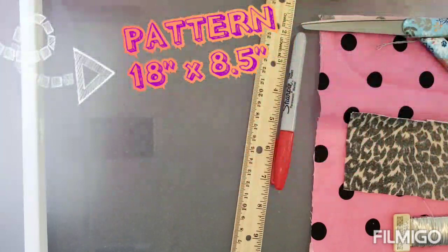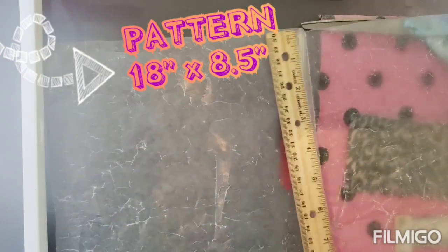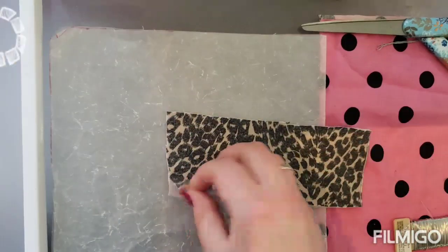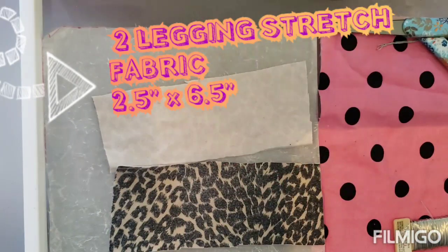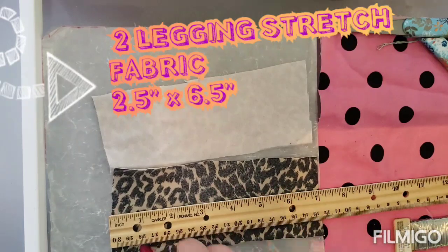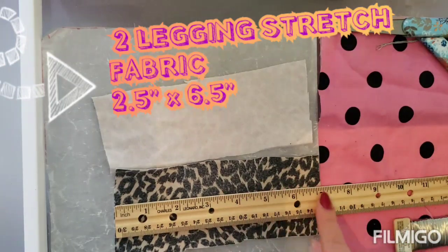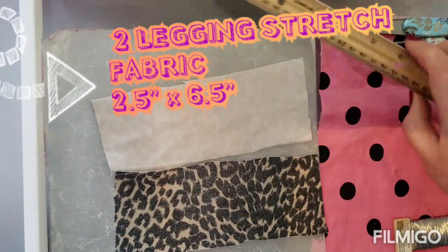The main fabric piece should be 18 inches in length by eight and a half inches wide. You can go a little bigger if you want, but eight and a half is pretty good. When you fold it you get a nine-inch square. For the ear straps, I've cut two pieces from old legging material — it's really stretchy. Cut them somewhere between six and seven inches; it's better to have a little more than not enough.